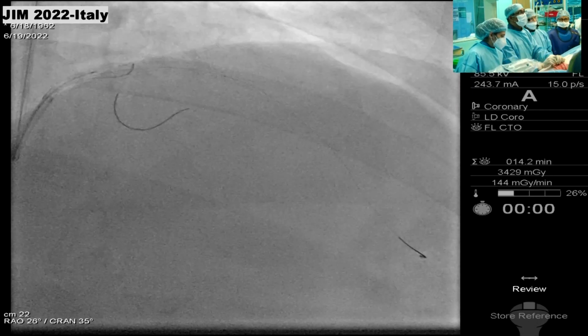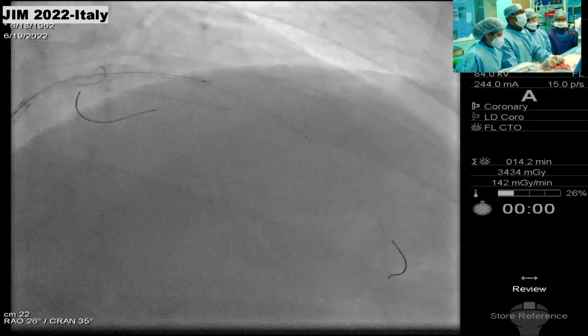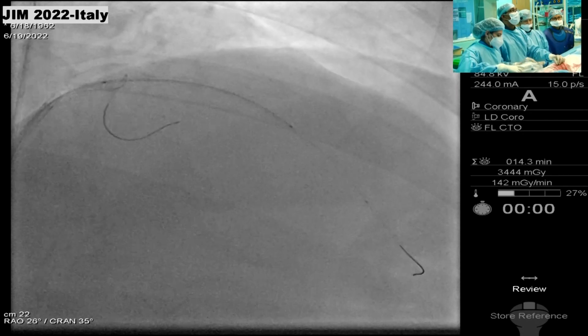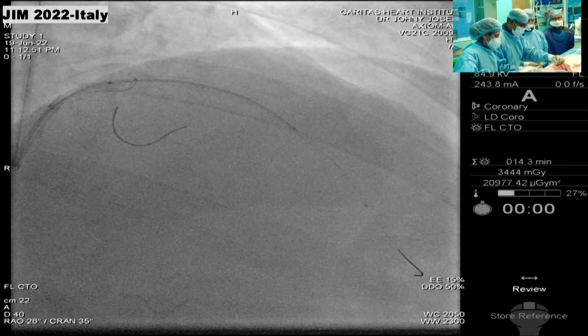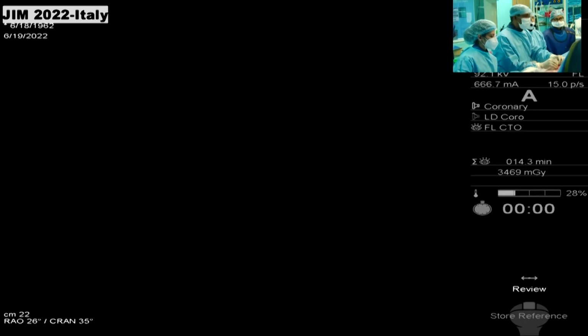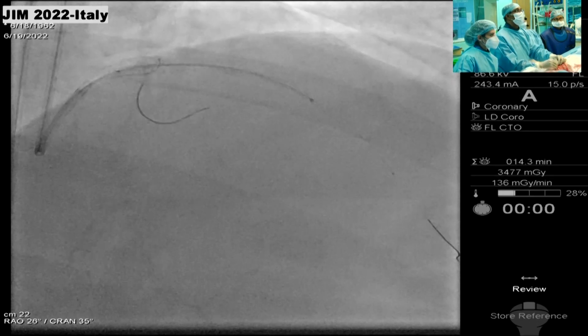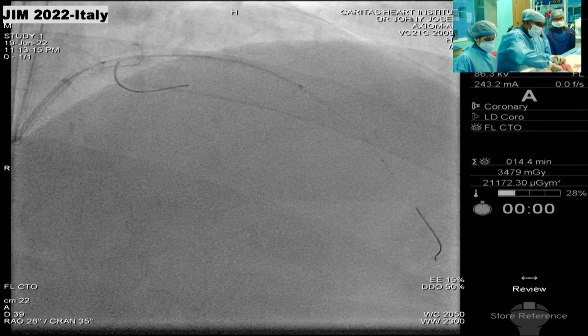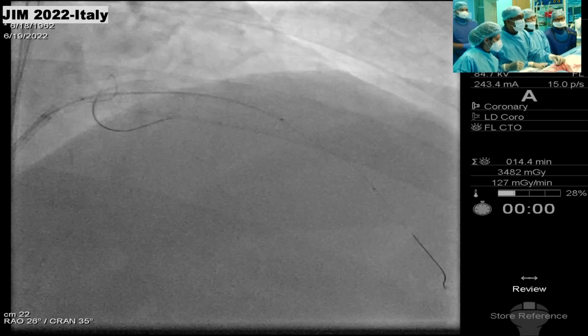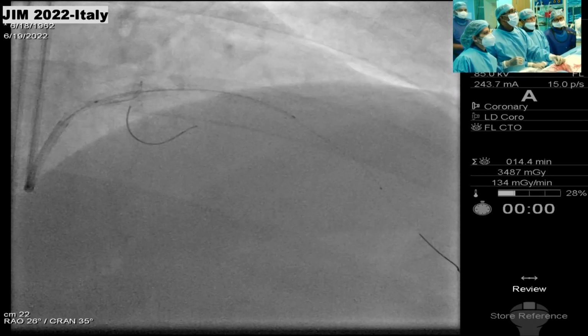Yes, the OCT. While they do that, George, left main in the US almost automatically means Impella. So here there is a normal left ventricular function, you won't consider that? No. Hemodynamics remain extremely stable. I will not, but I definitely back out the guide before the OCT. Actually, I don't know how the OCT is going to work. Let's see how it works.